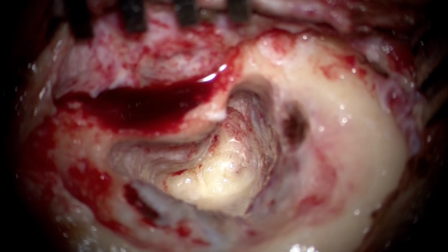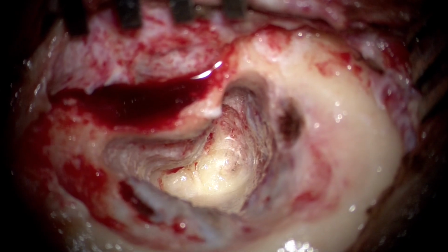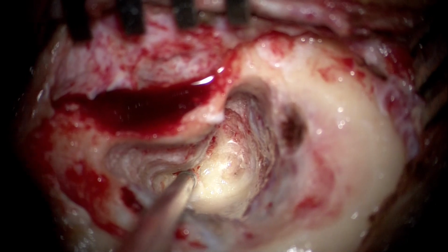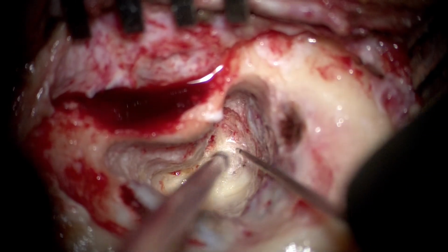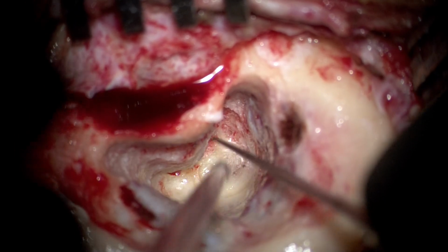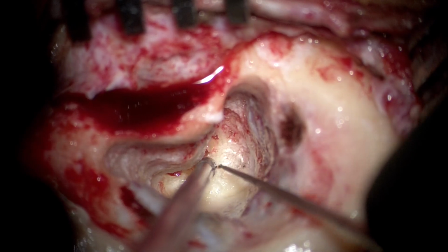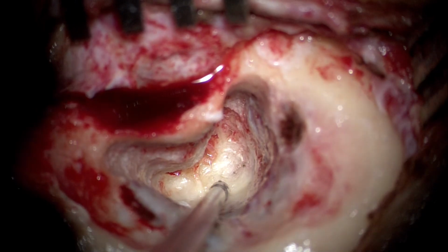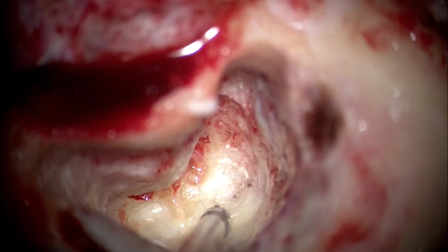Here we would need to just probably tilt the patient slightly anteriorly for us to be able to achieve a posterior vision, and the suction also has been changed into a skull-base suction, which is tapered towards the end and has an olive tip. So we can just use any kind of an instrument, maybe a sharp sickle knife or a right-angled pick to clear the sensory neuroepithelium from the vestibule, which is now seen very, very clearly.